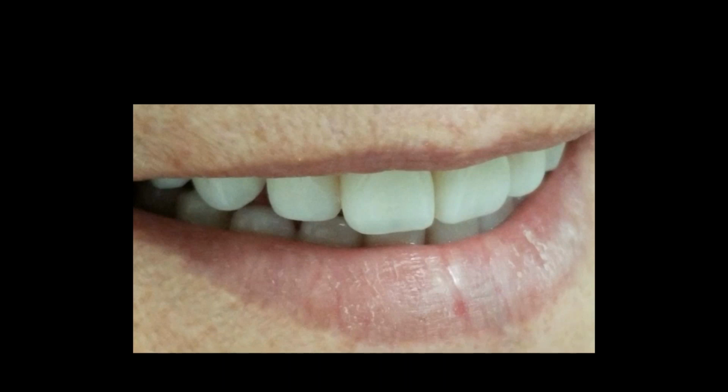Now I can clear things out. I know that on the guiding planes on her left side, I need to give her a little bit more room because she likes to drift out that way. So I can accommodate that. Even on a digital denture, I can accommodate for these things and I can adjust them. And then it's going to be more in line with what she needs and to function within her chew cycle. And these teeth allow you to do that.